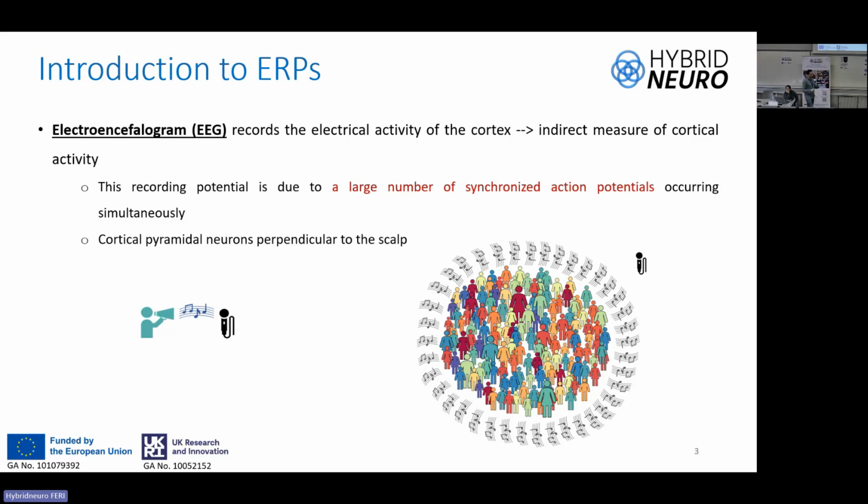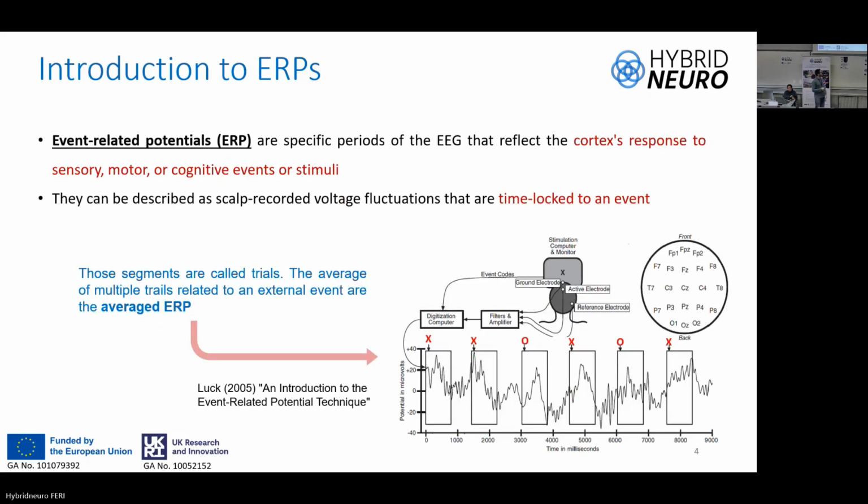with the EEG, maybe our objective is to characterize the cortical activity in some particular function, but the EEG involves the sound, in this case, of a lot of people. As the previous speaker said, if the local field potential is a part of a stadium, then the EEG is the whole stadium. So in this case, I will focus on the event-related potential.